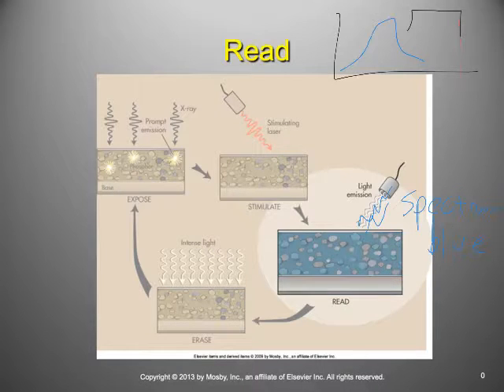Any process of receiving analog signals for storage and analysis, we will call that signal sampling. Okay? Signal sampling is the process of receiving analog information or analog signals for storage and for processing. So the light that's emitted by the crystal is an analog signal. It's light, right? We're going to digitize that.